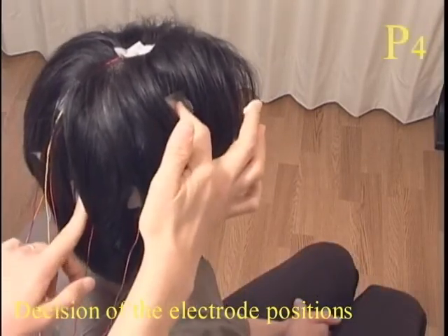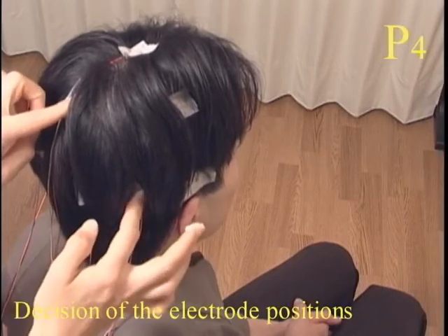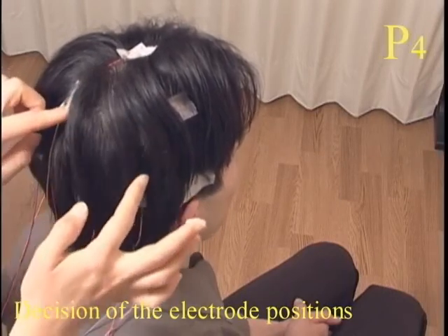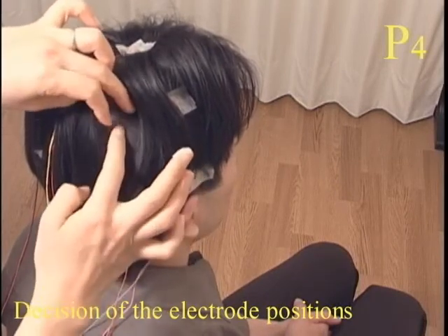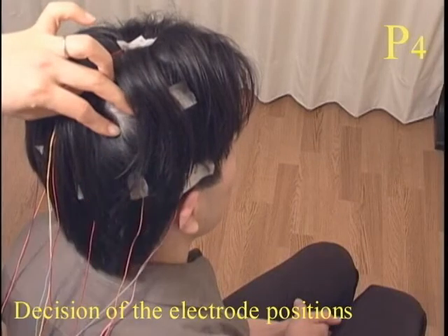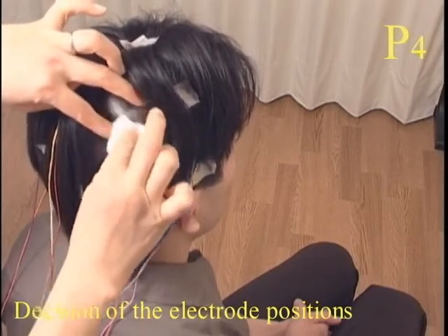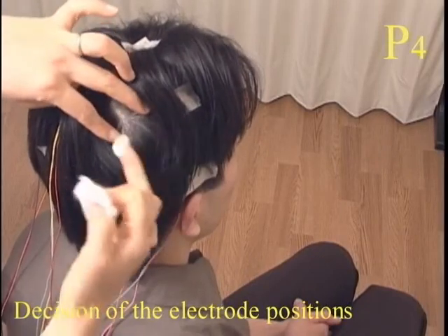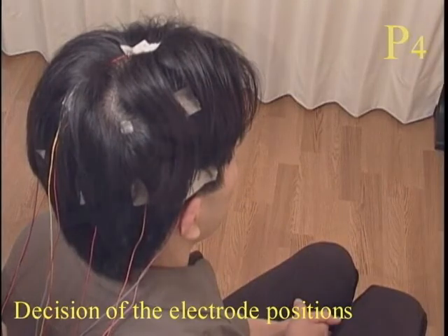P4 is located at the point equidistant from C4 and O2. At this moment, if the distances from P4 to T6 and P4 to PZ are equal, then the electrodes have been placed properly. Locate P3 using the same procedure. Then all the electrodes for the posterior part have been attached.